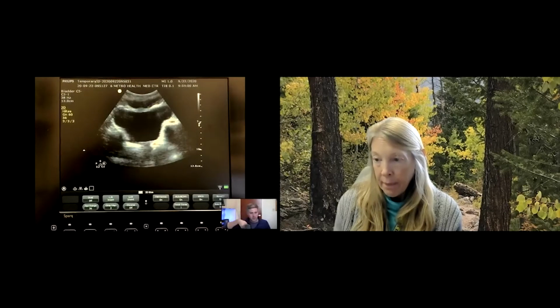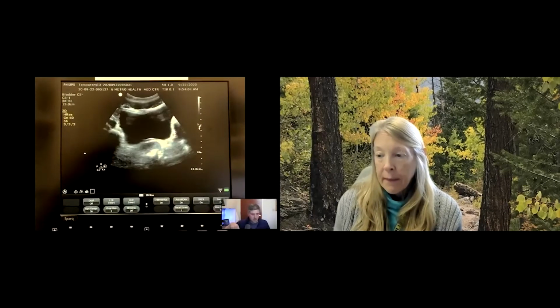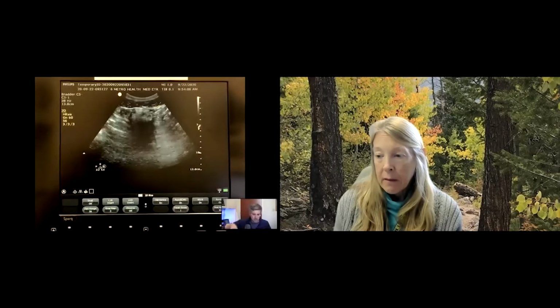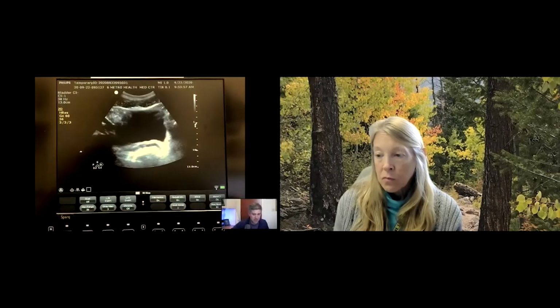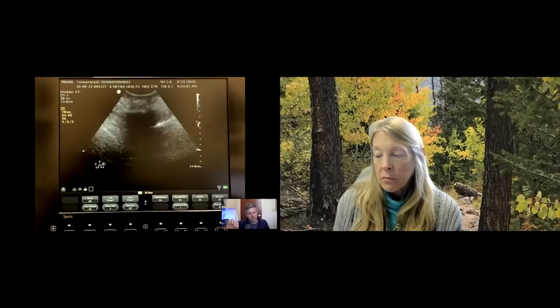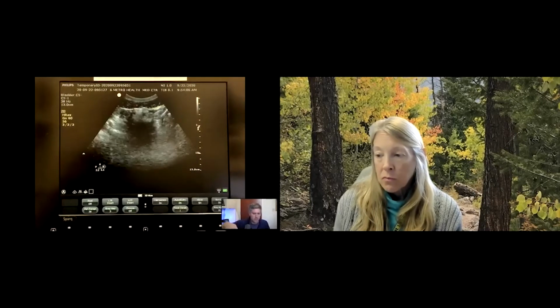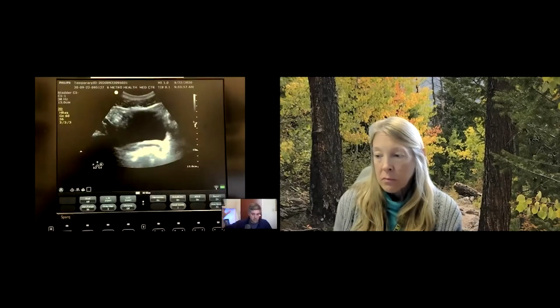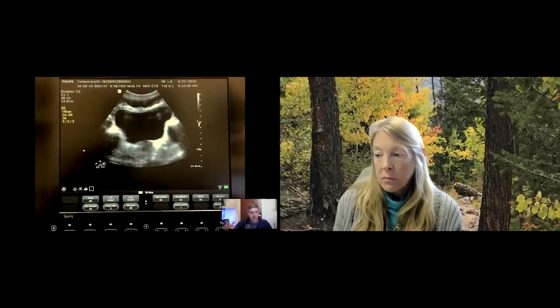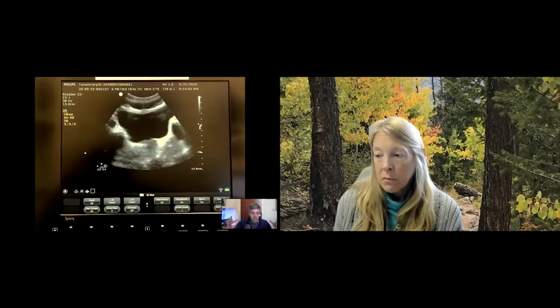So you put your probe down, find your bladder, right? Identify your pubic symphysis, go right above it, and scan all the way down to the bottom, not the urethral meatus, the urethral outflow of the bladder, and then scan all the way up past the dome of the bladder to get to the top, right? And see all of that and stop and freeze your study where the bladder diameters and dimensions are the biggest, right?